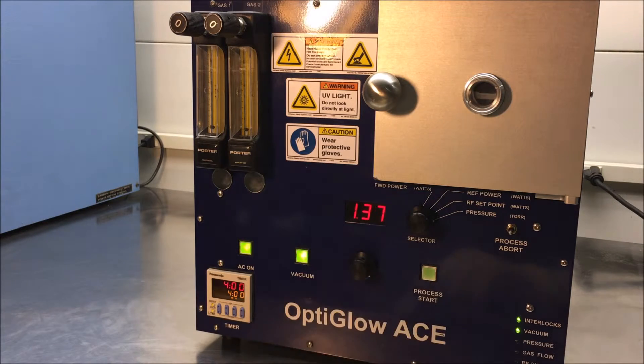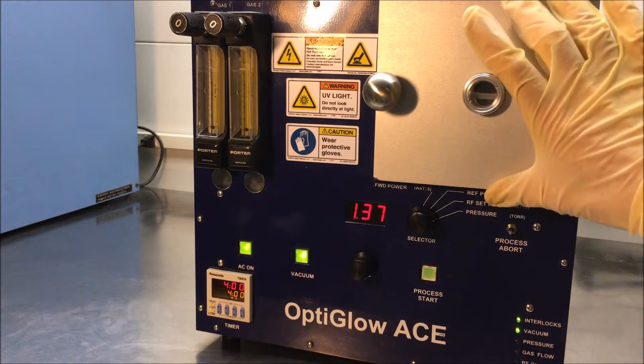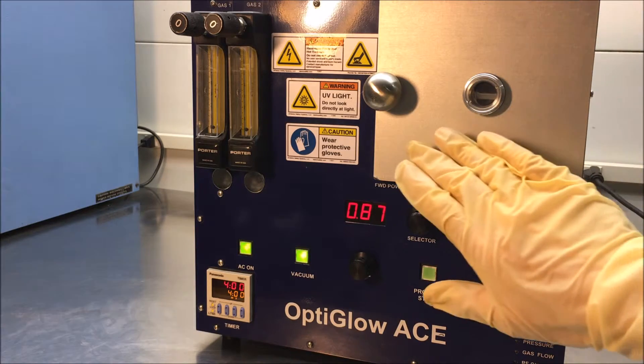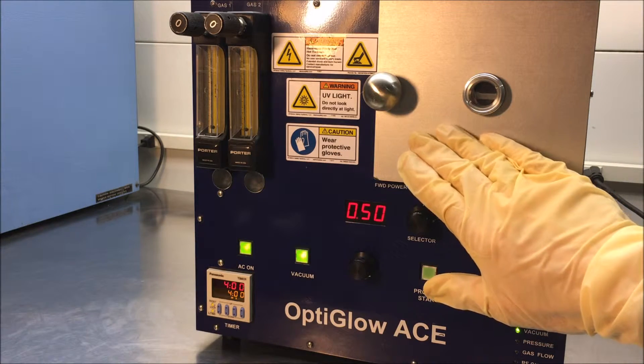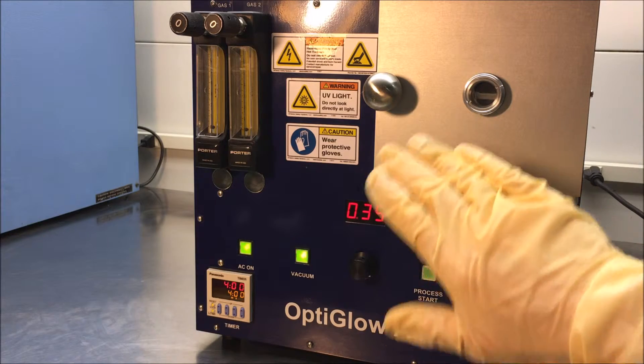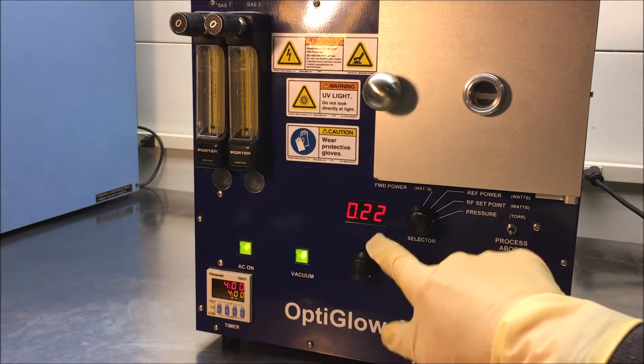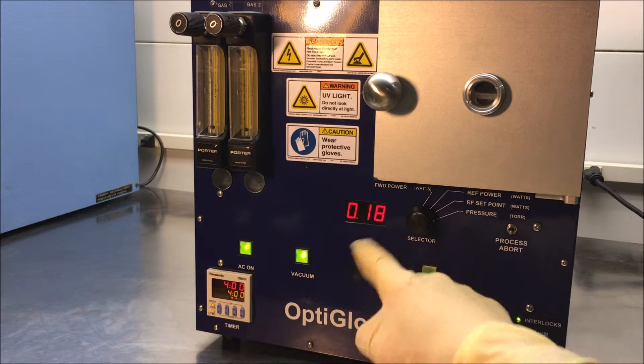Then you press your vacuum. That will bring the door in. Notice that in the hinge here, it has a dynamic offset so that the wall of the door will go directly in and will not pinch the o-ring. You'll notice that we're down at a pressure reading of 0.18.